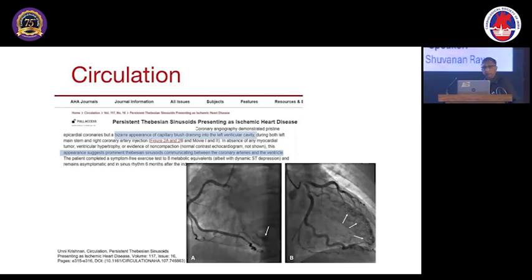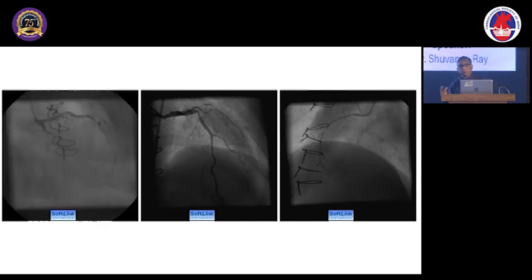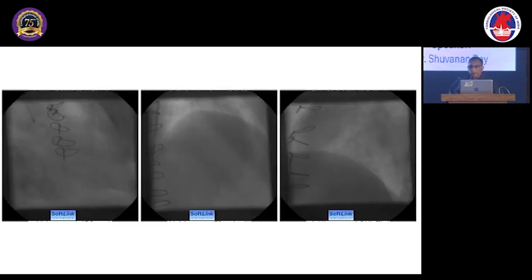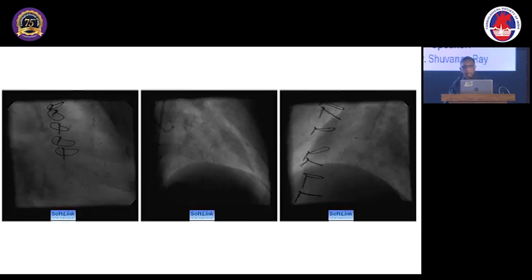And it is usually missed in 31% of the cases. This apical type of cardiomyopathy is missed in echo. This is a report you can see on the internet that apical cardiomyopathy is often missed in echo. In this patient, the echo was normal, and the angiogram was normal, and this had a spade-shaped deformity. They come with angina, sometimes arrhythmia, so you need to be particular about these patients and need a follow-up.